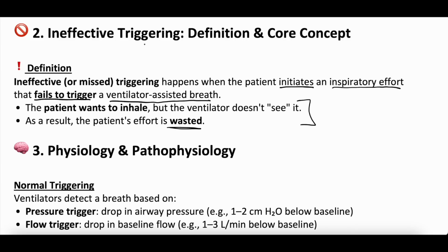To understand this a little bit, just to go back a notch, it helps to understand how ventilators give breaths. The vast majority of ventilator settings are AC, assist control. This could be AC-VC, volume control, or AC-PC, pressure control.